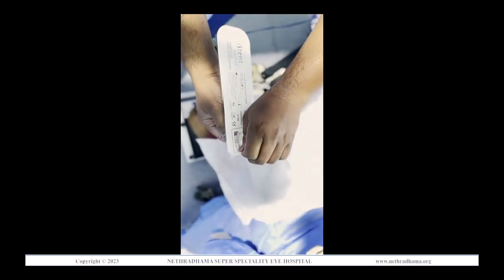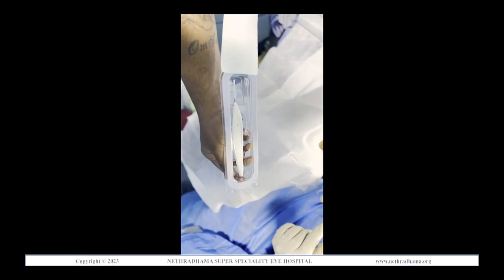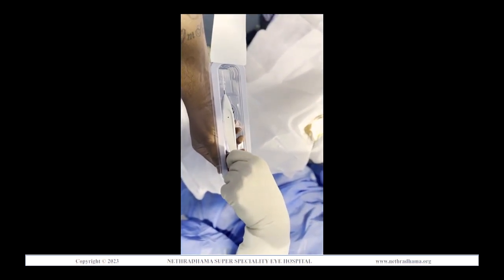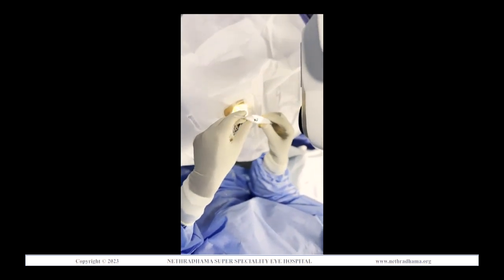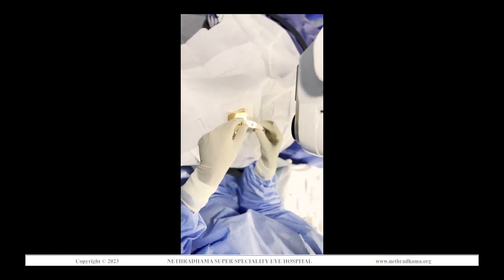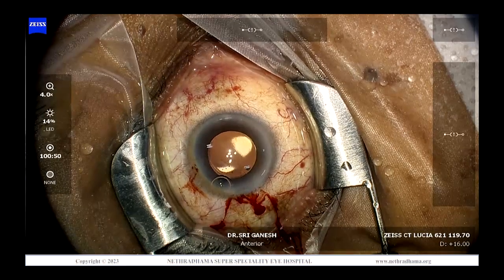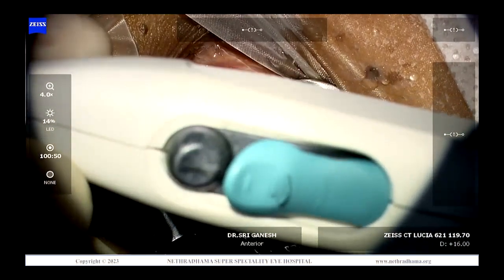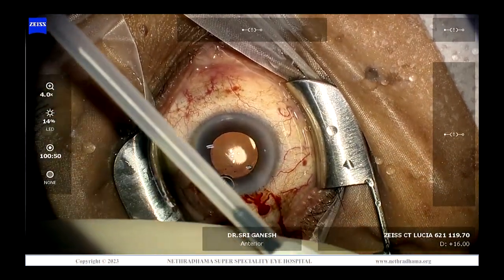This is the iStent inject. This is how it comes. We open it from its packaging and remove the protective sleeve there. Under the microscope, you'll see that it has a hollow metal tube, which is the sleeve, which protects the trocar. And these are the two buttons. The green button here is to slide back the sleeve, and the black button is to inject.